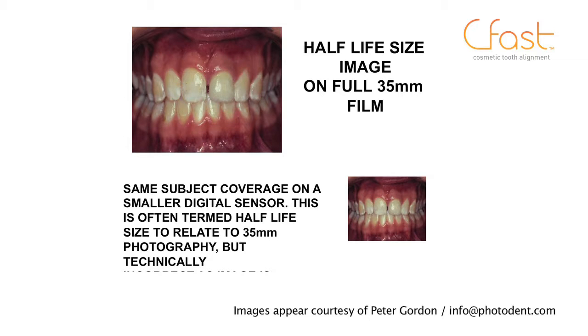Now finally, we need to be aware that digital sensors have a magnification factor. Unless you're going for a very, very high-end professional camera, the sensor will magnify the view by 1.5 times. So we refer to the image as a 1-to-2, but the setting on the camera is actually set as a 1-to-3 because of that magnification factor. So similarly, a 1-to-1 view we set on the camera as 1-to-1.5. The terminology of 1-to-2 and 1-to-1 is very established and won't change, and we therefore just have to accommodate that with the digital sensors.